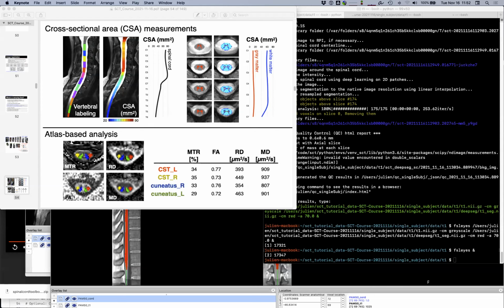I think Pedro, yes, you raised your hand. Yeah. So just to understand, the segmentation of tissues is not automatic. I mean, it's based on registration, but it's not estimated based on voxel intensities, like in the brain, isn't it? Right. So it's a key question. So the segmentation of the spinal cord is based on the intensity of the pixel. Okay. Of the tissues, like white matter, gray matter.